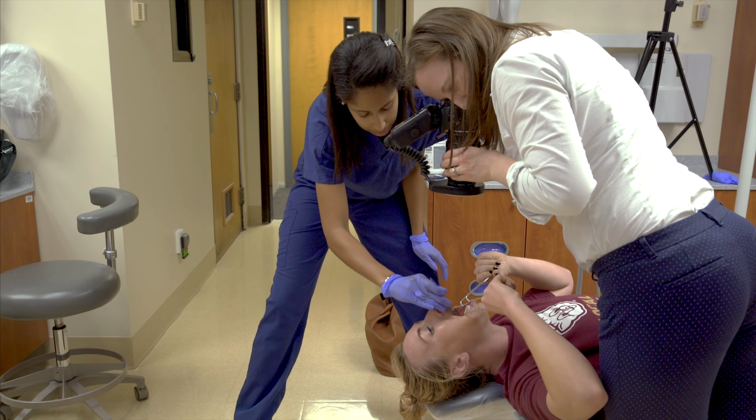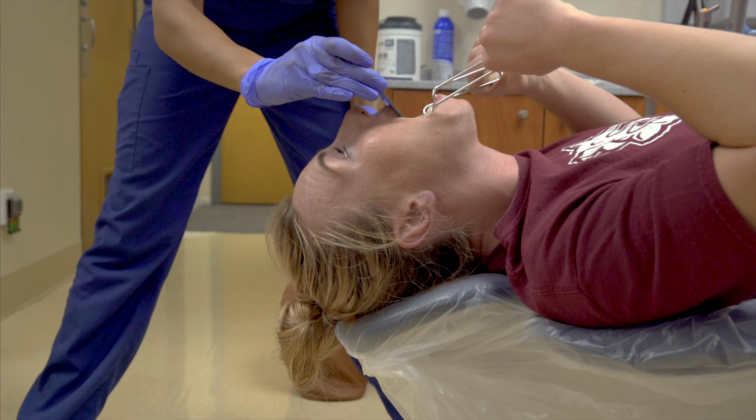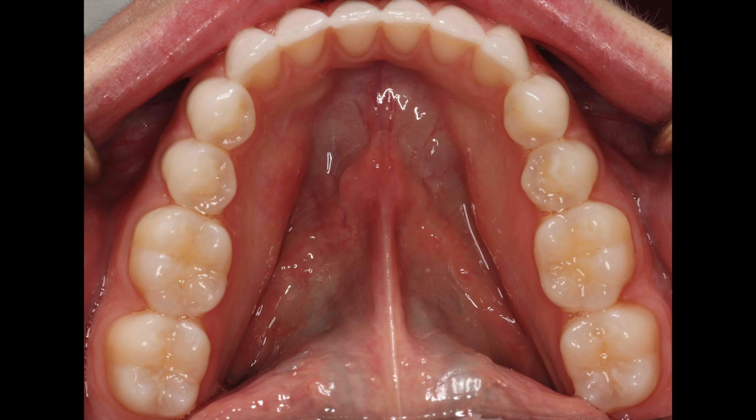Once the patient is set, ask the patient to tilt her chin upwards as much as possible, as shown here, and then snap the photo. It helps the photographer if you lower the chair towards the ground as much as possible.